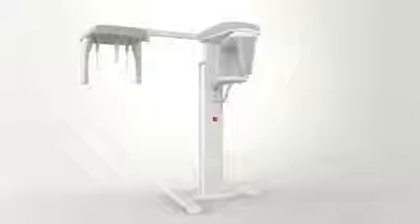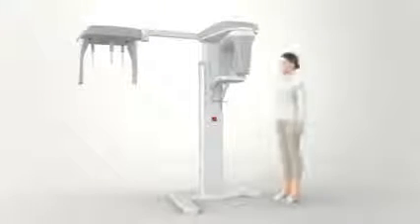After the equipment stops moving, install the chin support and bite block. Move the canine laser beam and the Frankfurt plane laser beam to the initial position. Guide a patient to the unit.